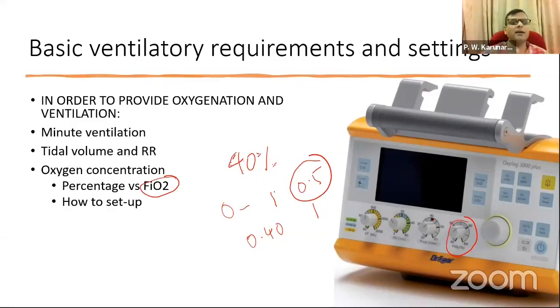Now, setting up, how do you set the oxygen? Sometimes it is a knob like this. Sometimes you have a separate oxygen controller at the side of the ventilator. I'll show you. That's how you have to know how to set up the oxygen.